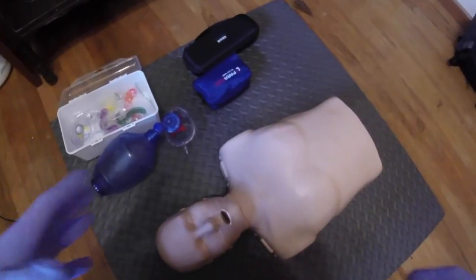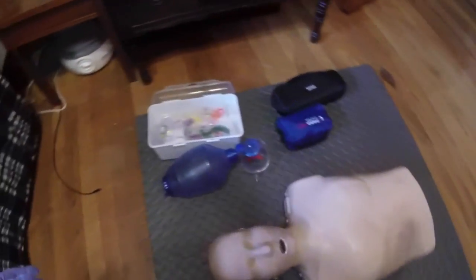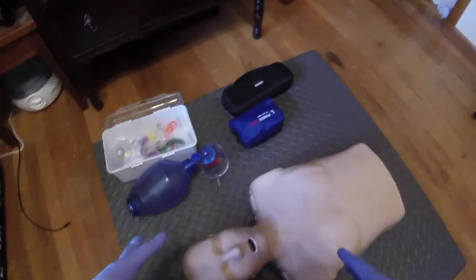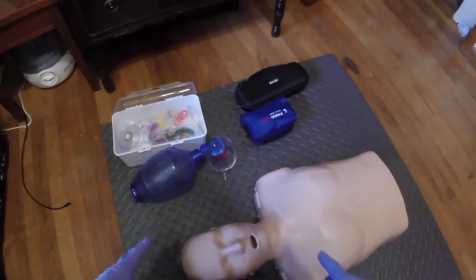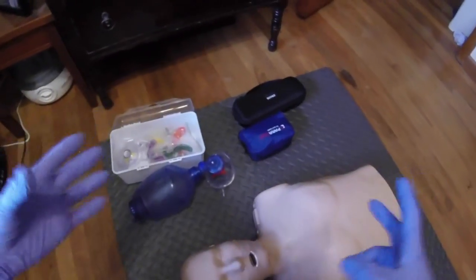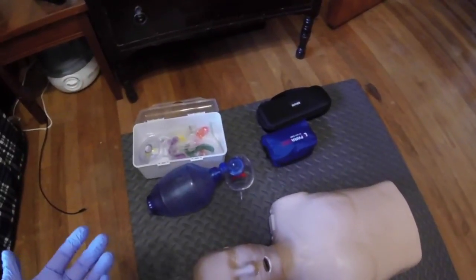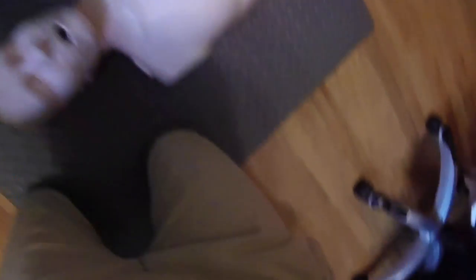I do not have the nasopharyngeal airway because my mannequin does not have nares that you can access, so I can't show you that. But I do plan on getting a mannequin in the future that I can actually access the airway with, especially for when I do paramedic school.